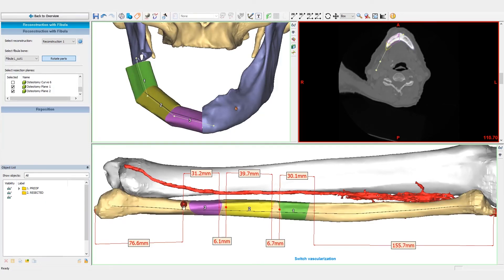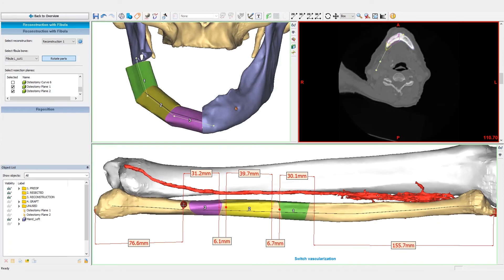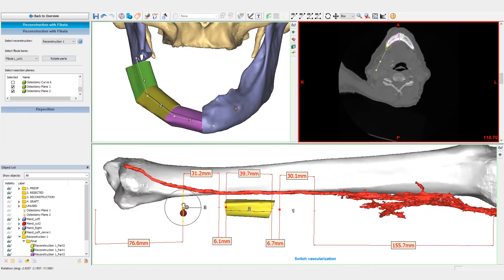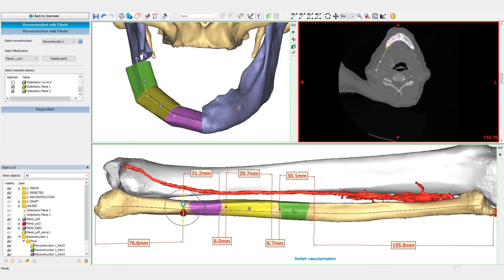Or we can also directly work on the Fibula itself, where we can translate and rotate the segments to optimize the osteotomy direction according to the tibia and the blood vessels of each patient.